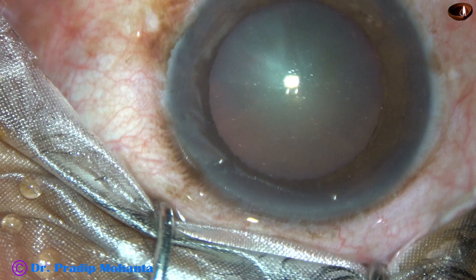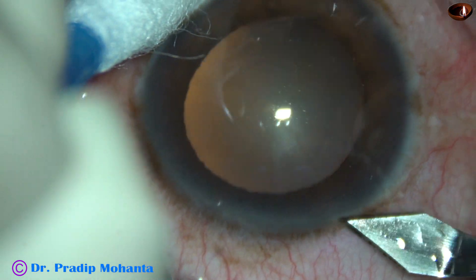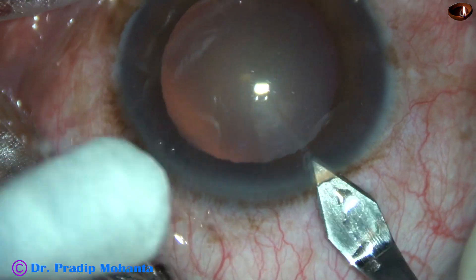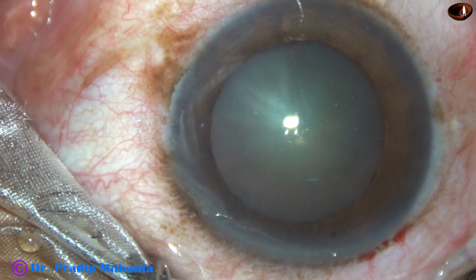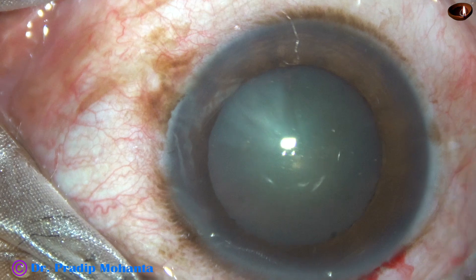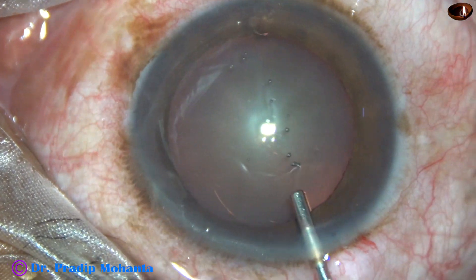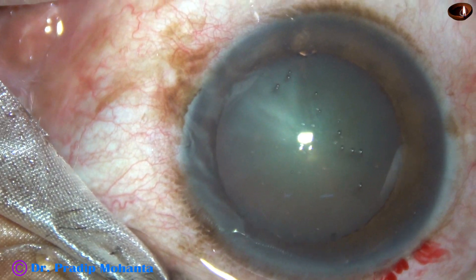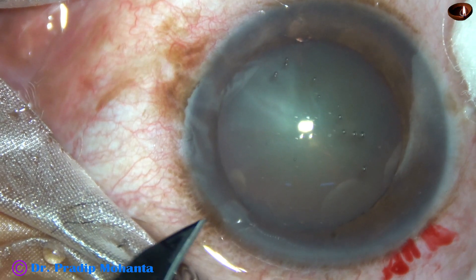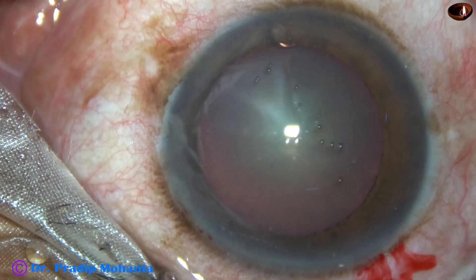In this video I want to show my lens tilt technique for soft cataracts. This is the main incision with the 2.8 millimeter steel keratome at around 135 degree axis. Now the entire chamber is filled up with 2% hydroxypropyl methyl cellulose, and this is the side port on the left side of the main incision.